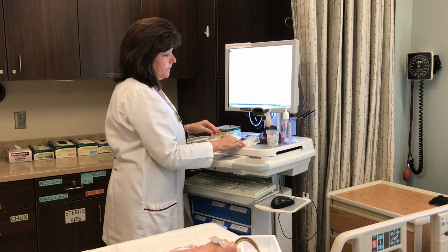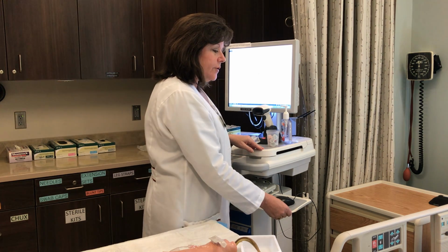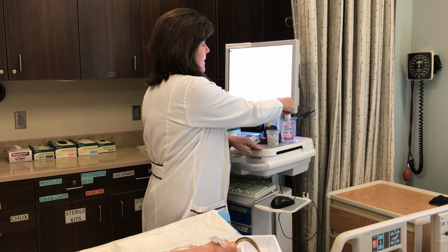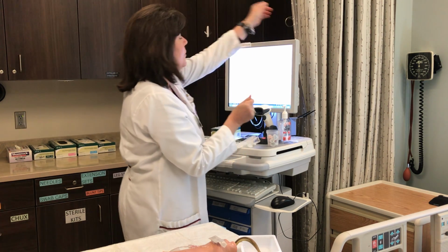Introduce self, name and credentials. Hi, I'm Mary Jo, the RN going to be taking care of you today. Perform hand hygiene and provide privacy. I would pull my curtain.